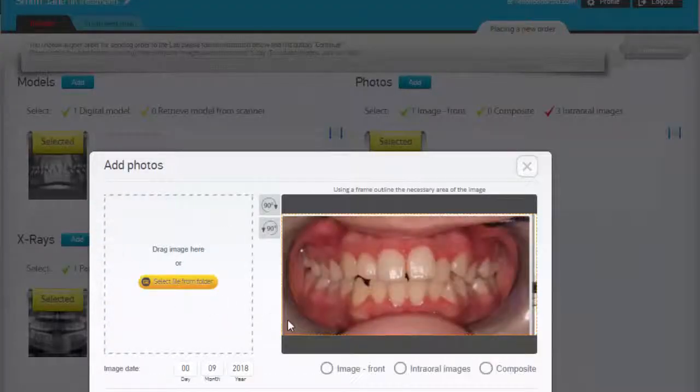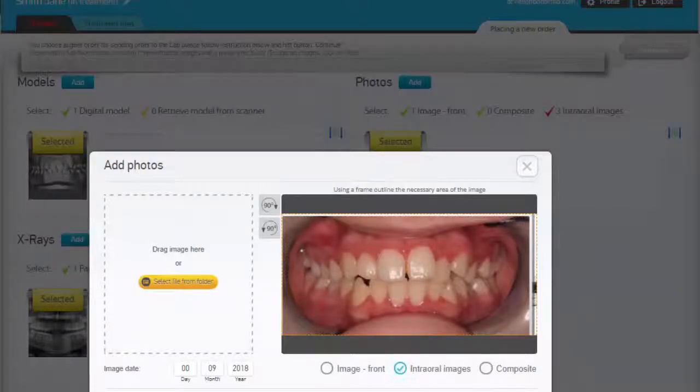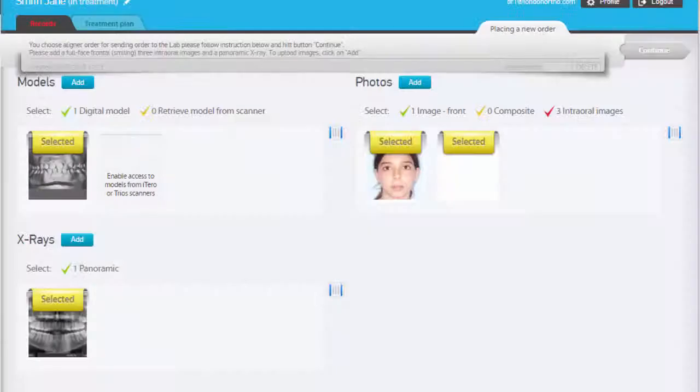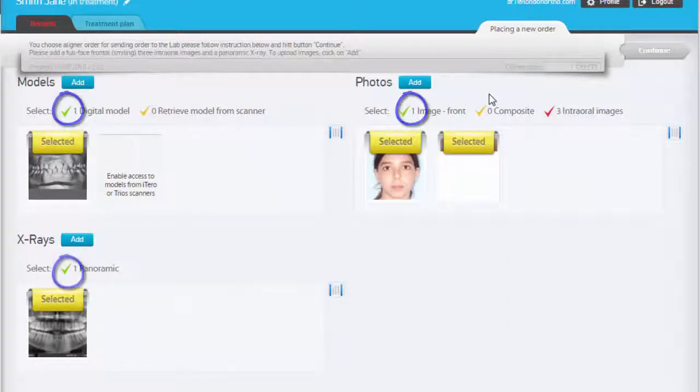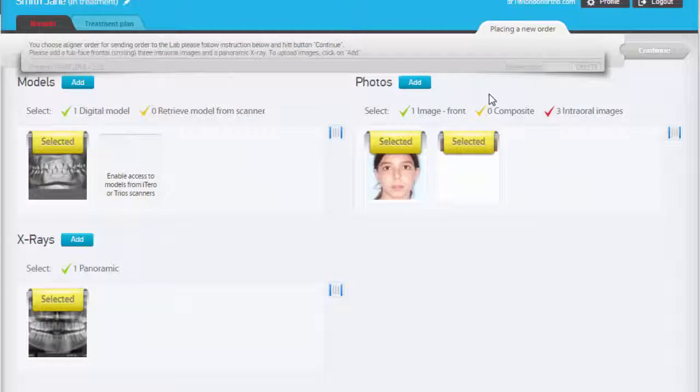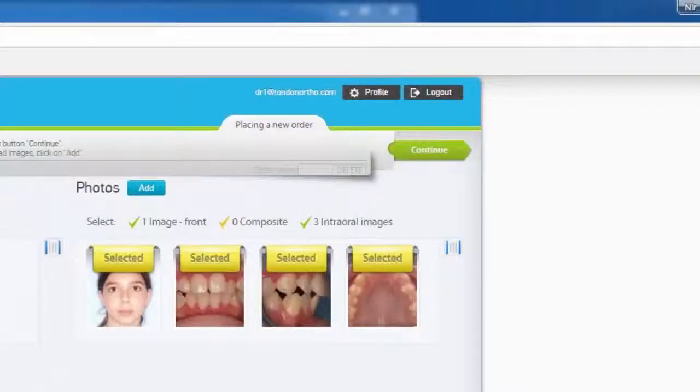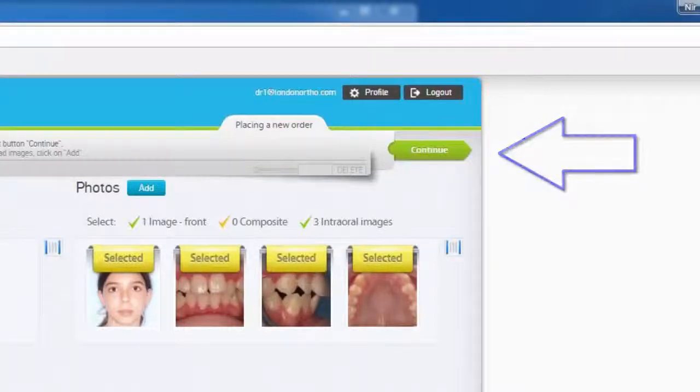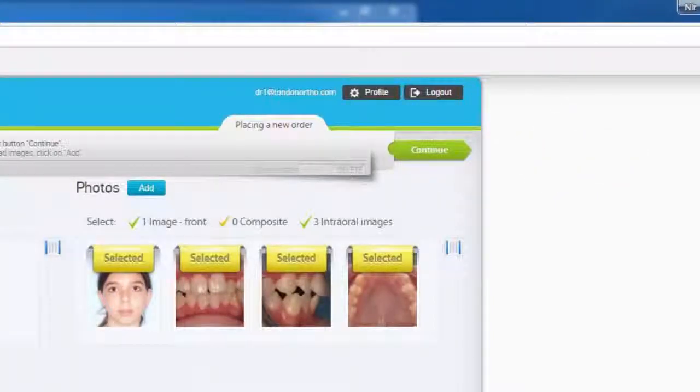When finished, click Select on all relevant images and files. The green checkmarks will indicate that the system has enough data to proceed. When all files have become available, the Continue arrow becomes green and clickable. Use it to move to the next step.